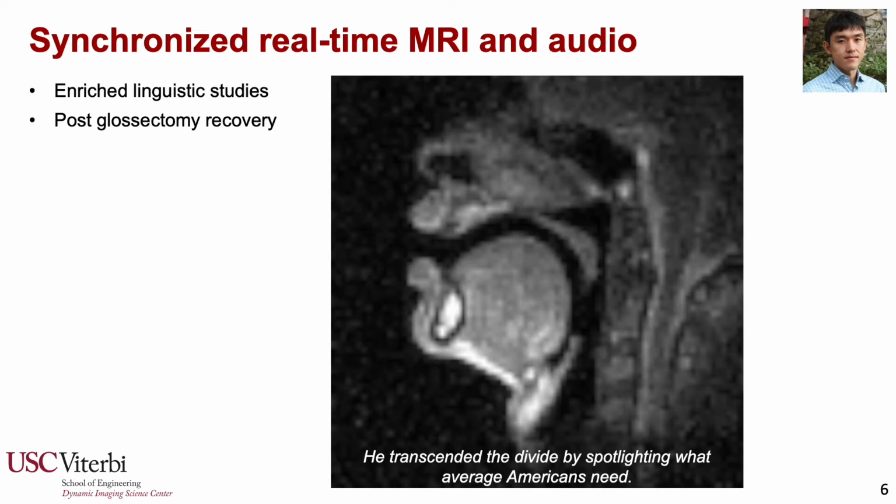So this real-time imaging system greatly enriches linguistic studies and also has some clinical usage, such as post-surgery recovery.